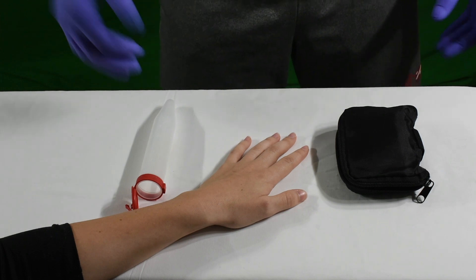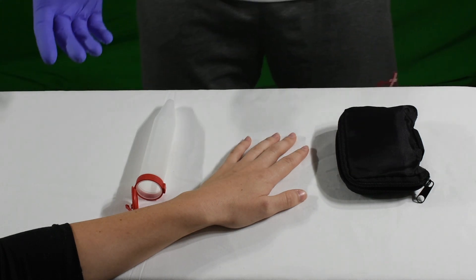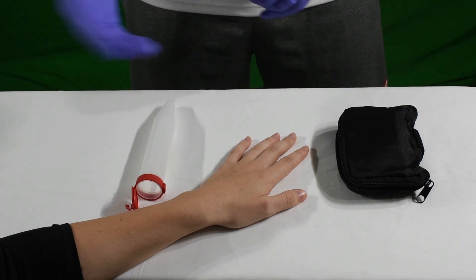BSI scene safety. I want to assess the need for blood glucose monitoring for my patient. Usually an example of this would be a patient that's altered.